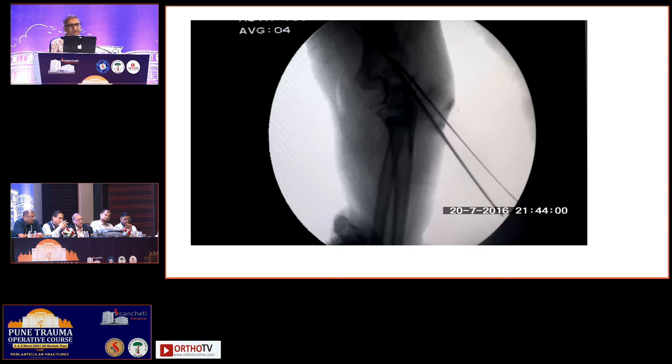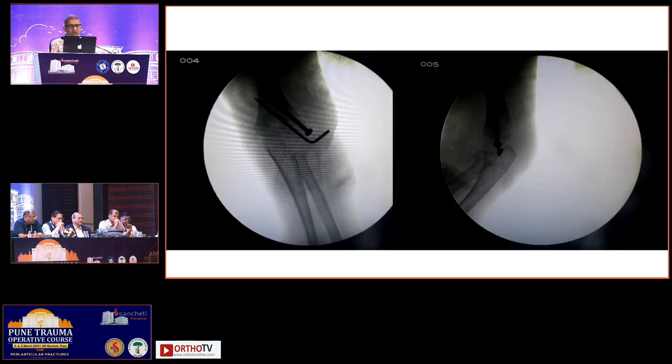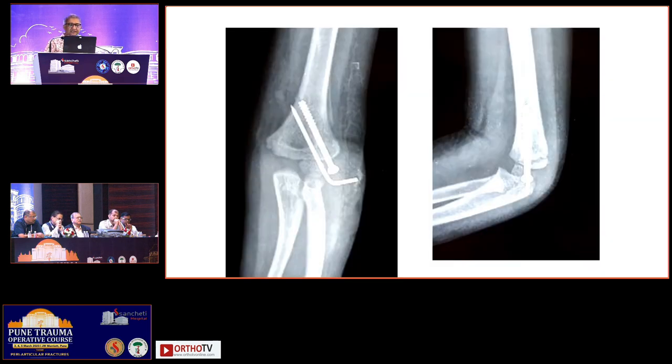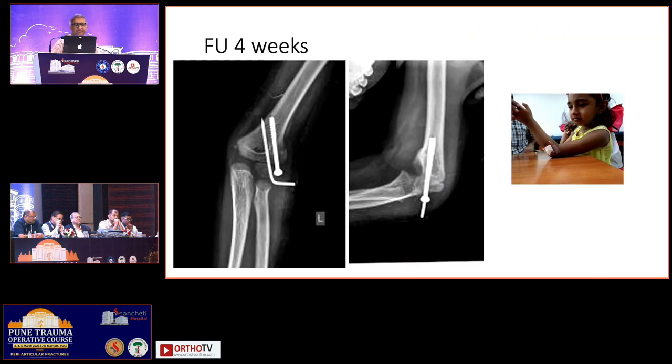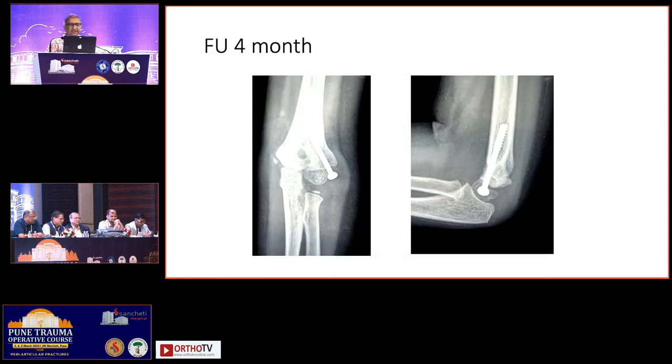Pass one more wire, so two wires, and from one of the wires you will drill and then pass the screw. So a compression screw through the metaphyseal side, and an additional wire to prevent rotation, and then this is a post-op X-ray. At 4 weeks, you start mobilization out of the plaster. At 6 weeks, you remove the wire, because the wire is protruding. It is within the skin, but that hampers the movement. So at 6 weeks, I remove the wire, and at around 6 months plus, you remove the screw.